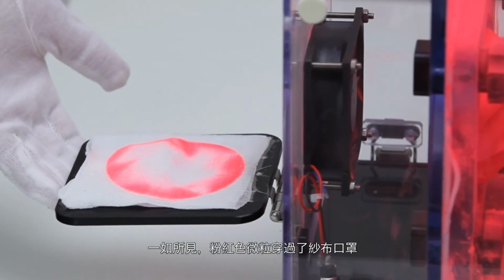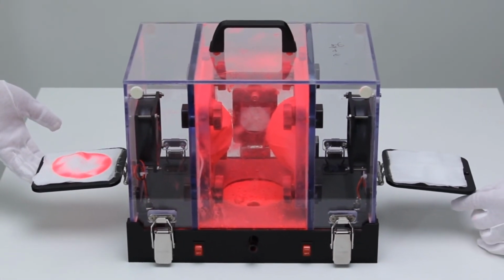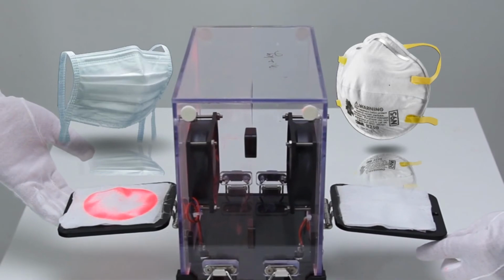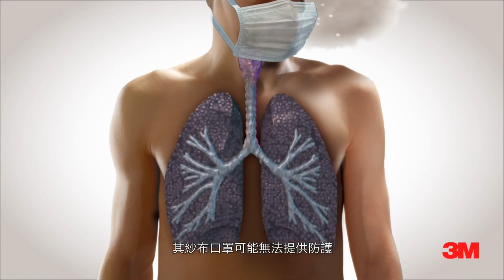As you see, the pink particles have penetrated through the gauze mask, but not the 8210 filter. This shows the distinctive performance difference of the gauze mask and the 3M respirator. Also, gauze masks are not designed to fit tightly to the face, so there may be leakage there too. If a person wore this gauze mask in an environment with these sized particles, the gauze mask might not protect him.